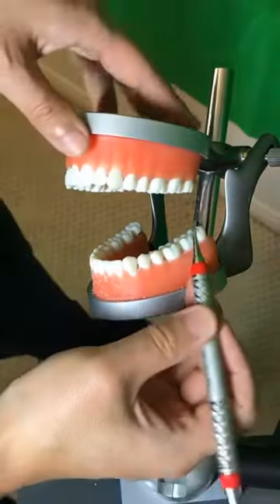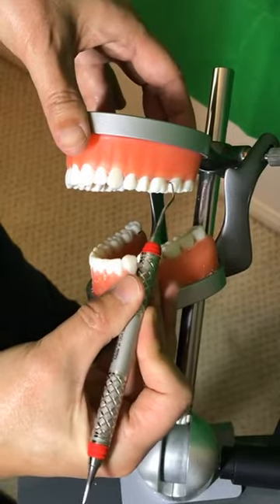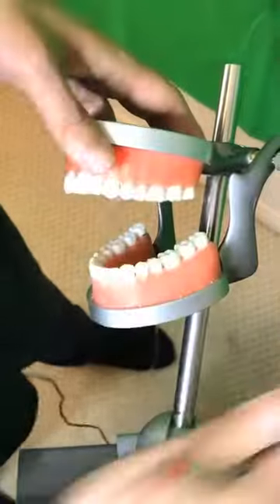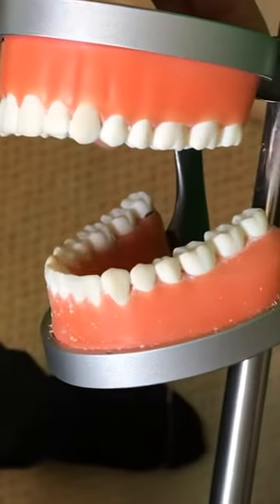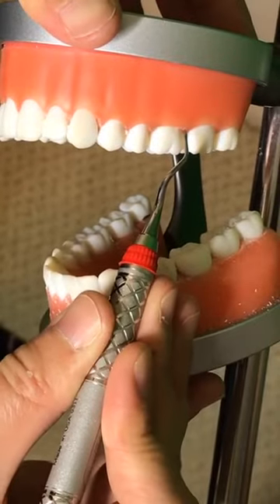Then using this cutting edge here, I'm going to use extra oral fulcrum. Another thing is, Gracey is very easy to identify. If the terminal shank is not parallel, you cannot really use it. So here it's extra oral fulcrum right now.